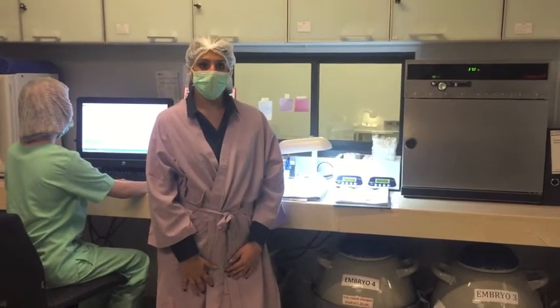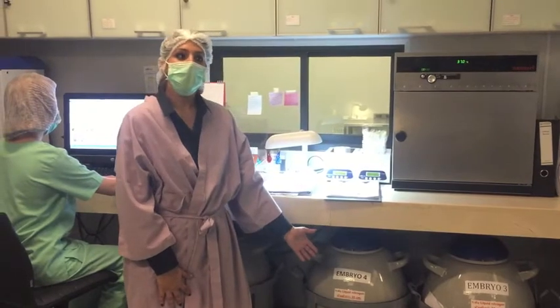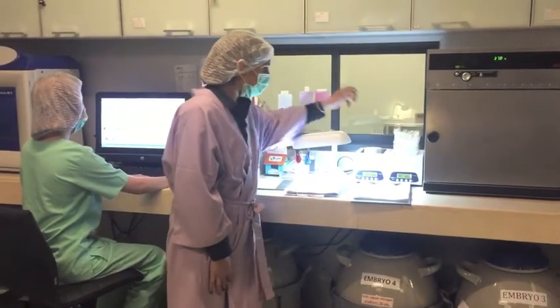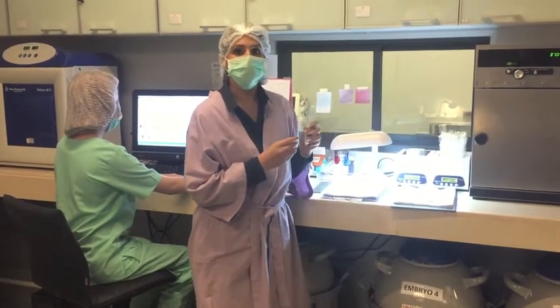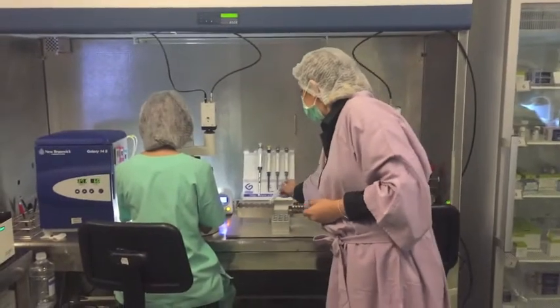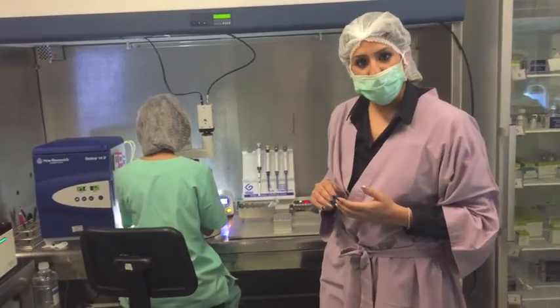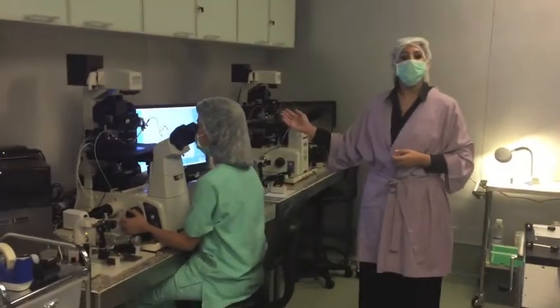Welcome to the embryo lab. As you can see below is an embryo storage tank that we use to store embryo below 195 degrees in liquid nitrogen solution. Once the doctor hands over the egg collection container to the scientist, it is then moved to the oocyte machine where the scientists will analyze and check for the quality of the egg. Once that process is done, then it's moved on to the ICSI and the biopsy machine.